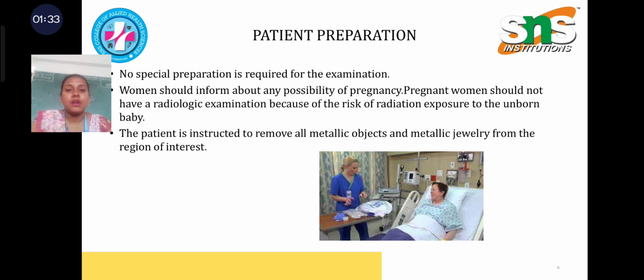Patient preparation: no special preparation is required for the examination. Women should inform about any possibility of pregnancy. Pregnant women should not have a radiologic examination because of the risk of radiation exposure to the unborn baby. The patient is instructed to remove all the metallic objects and metallic jewelry from the region of interest.